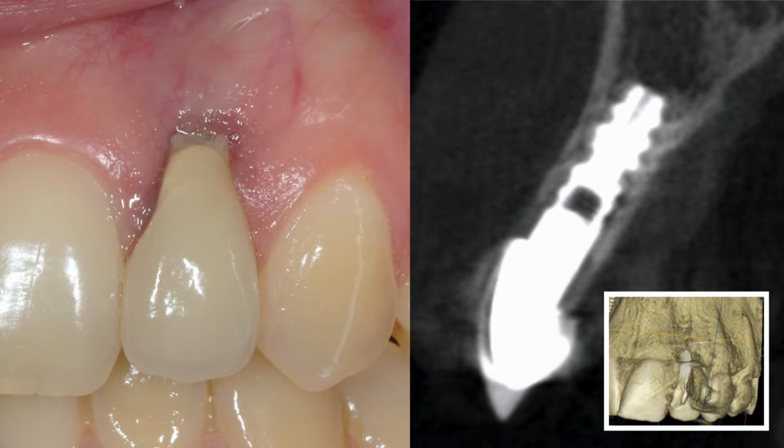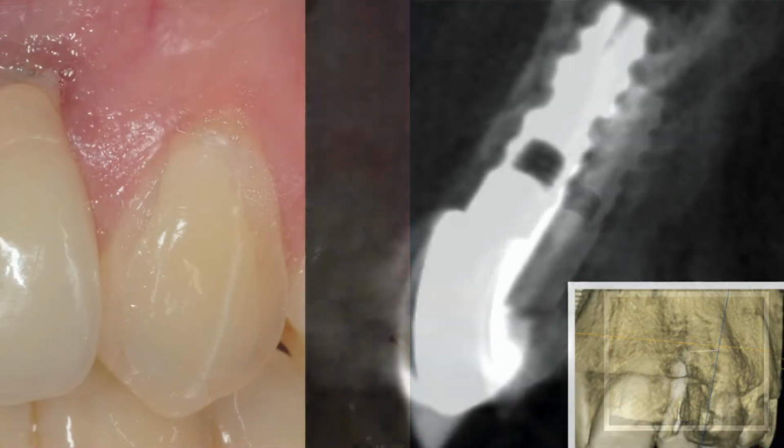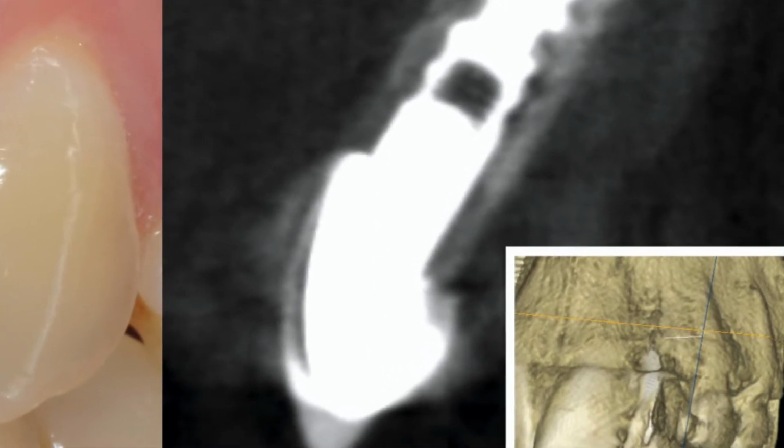Yeah. So this is the critical part, and I want you to see the emergence profile and contour of not only the restoration, but the shared crown and abutment, both sharing the emergence profile. And as Hamid is showing you, right there is the critical over-contour of the restoration, because the implant is placed so shallow. That's critical.